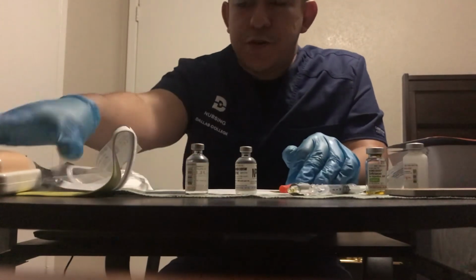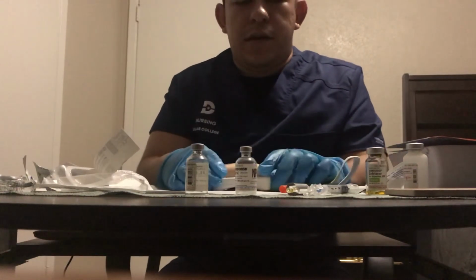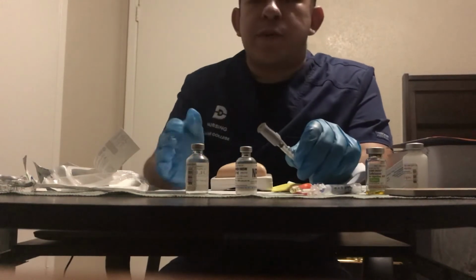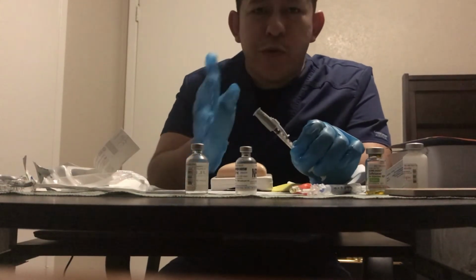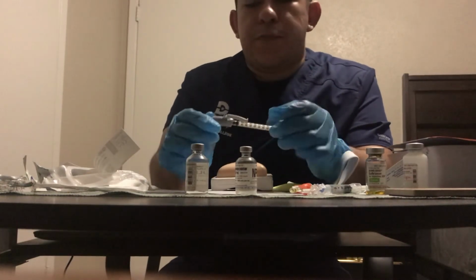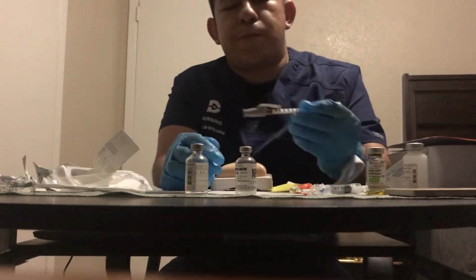So for the administration part, what you want to do is you go in the order of least painful to most painful, because if you start with most painful, they're probably not going to want to keep on going. So we're going to start with the PPD, or the intradermal one.